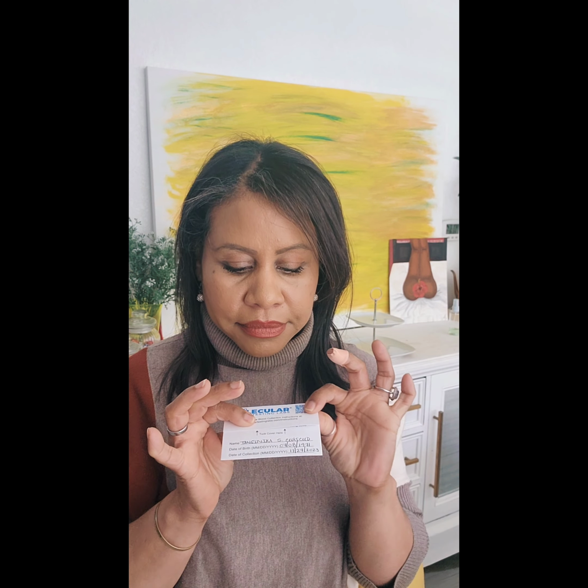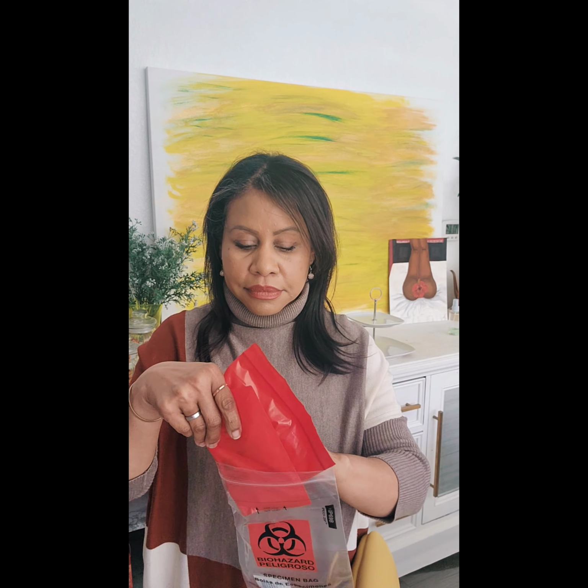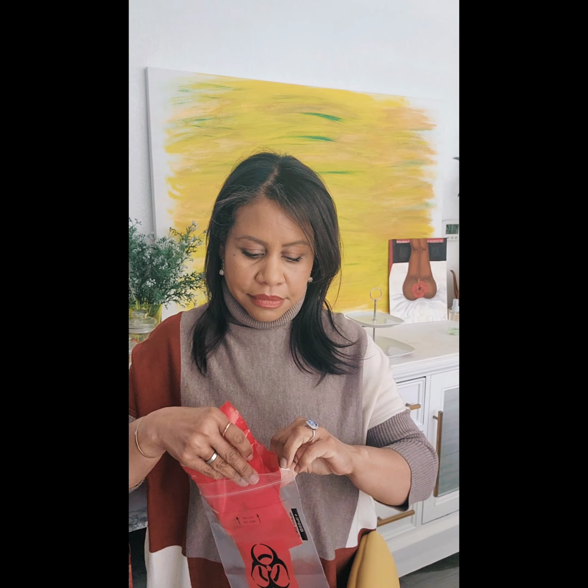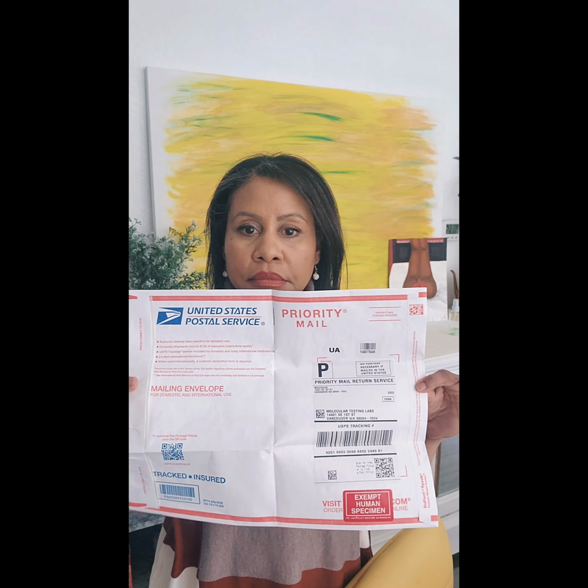This is showing you the blood sample. Yes, it hurt. I was not the most courageous doing it, but I did it. And then after you're done, you just fold the little card and then put it back in the bag. It's a red bag because it is actually blood product, and so it is super protected. It is actually more protected than the other ones. And then you just put that bag inside of the next bag, and you're done with that part. Minus, I hope, the pain in your finger.